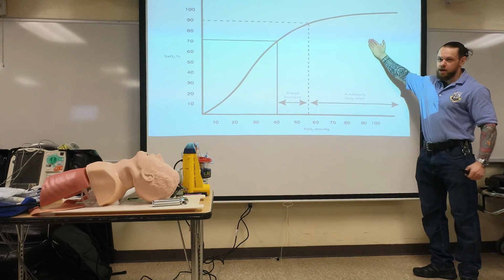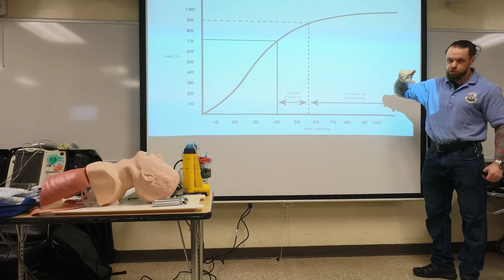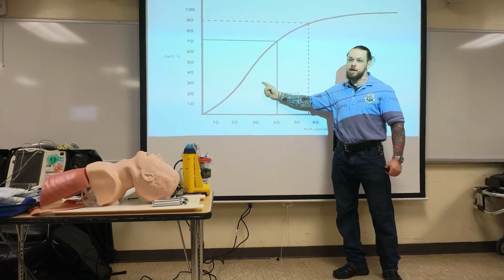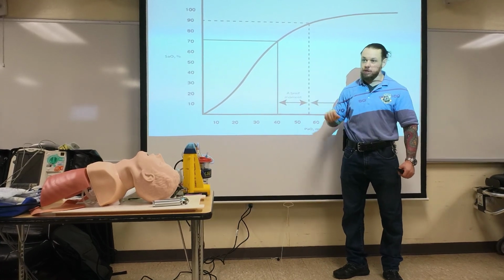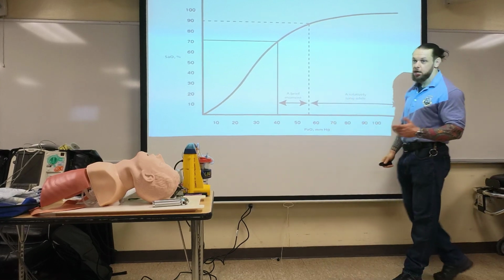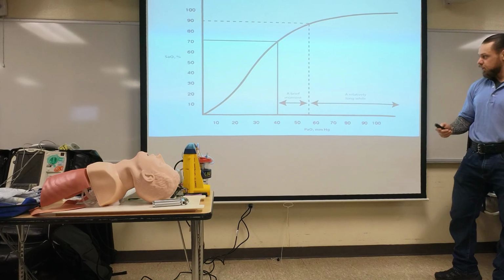Here you have a time frame, right? And the instructors before will tell you 30 seconds. You don't have 30 seconds. I'm going to show you true numbers. Here it's a very brief moment, and then they decide. This is how they get hypoxic brain injury. If you're at 90, you better stop doing whatever you're doing. Even if you see the vocal cords, you stop. You go back to oxygenation. You're going to kill the person. How are you going to kill him? By hypoxic brain injury.